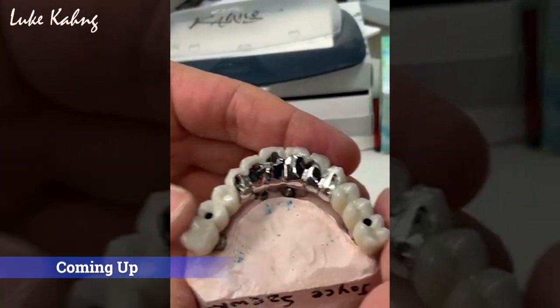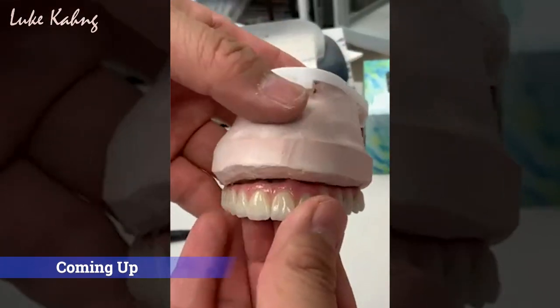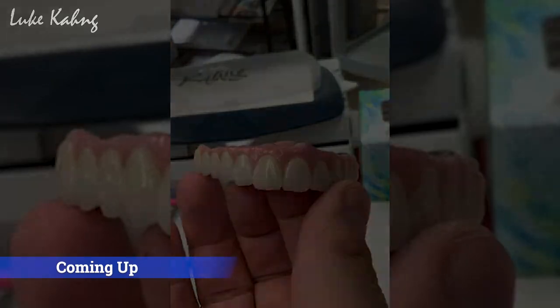Nice, it's an art. We finished that one. Alright, so now the patient can make the top of the line.